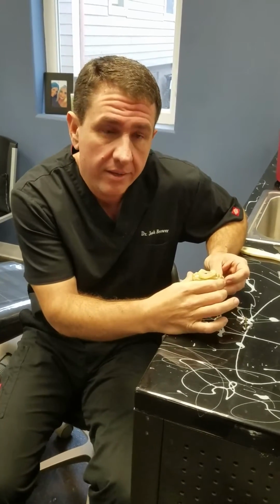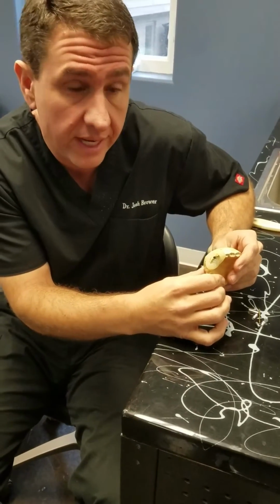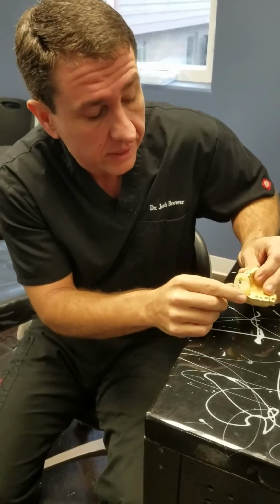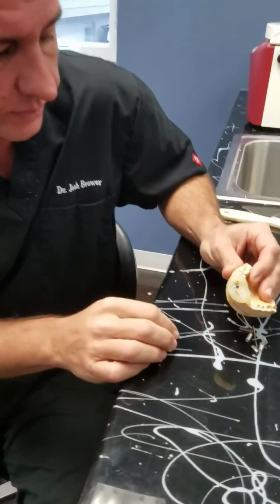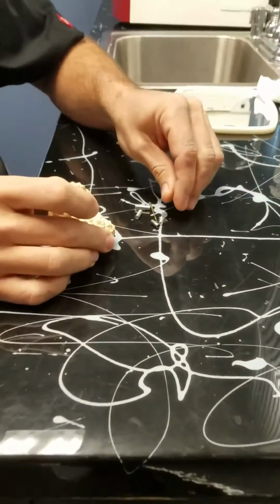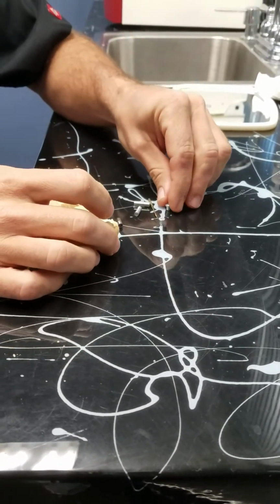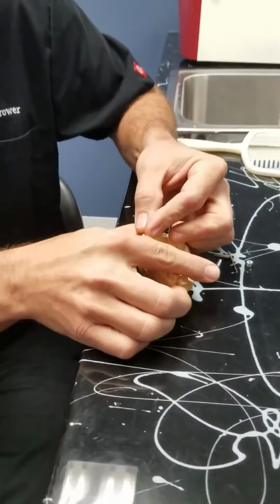Alright, this is how the implant system works for the mini implants that are fully guided above the bone. So here you can see we've got a guide with a surgical tube in it. And the surgical tube has additional tubes that go in it. The first stage that you would do is to find the smaller of the two pilot drill guides and place that in there.